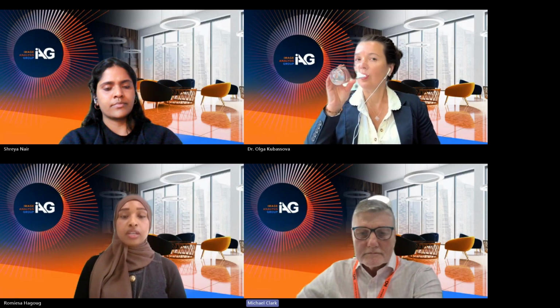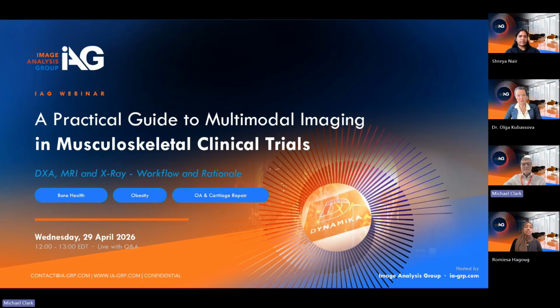But there are other criteria where adjudication may be triggered depending on the presence or non-presence of a fracture, and depending on areas of interest. Those are all aspects that are very well defined within our imaging charter. We will also have quality monitoring plans for all the studies where we see trending patterns throughout the course of the study. So we would make sure that we review and visualize the adjudication rate amongst our readers to make sure that they're reading as expected.